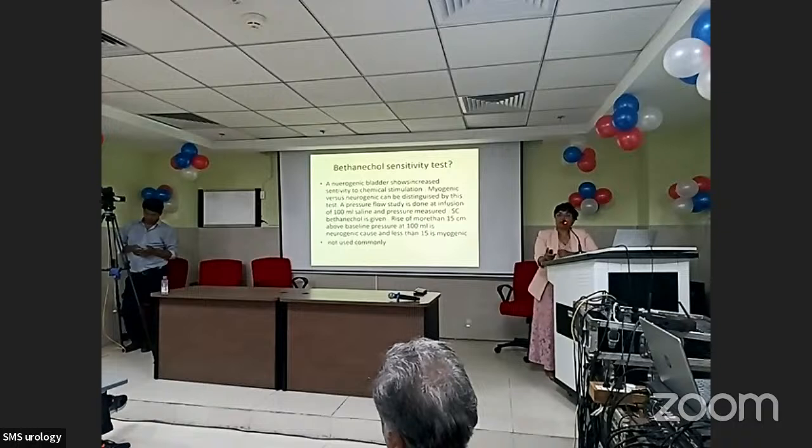And if it is a myogenic cause, that is, the detrusor itself has become fibrosed or non-contractile because of disease or prolonged obstruction or whatever be the reason, then it will not react. So this is the basis for the Bethanechol hypersensitivity test.